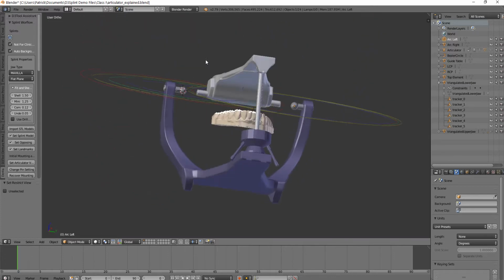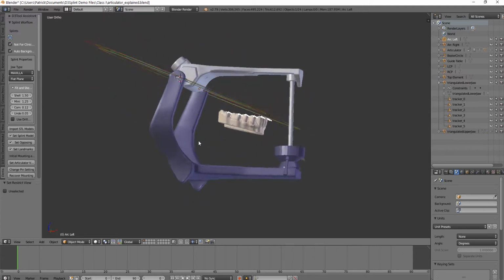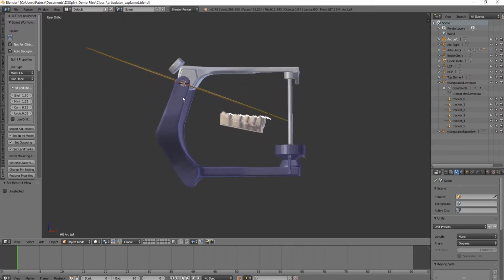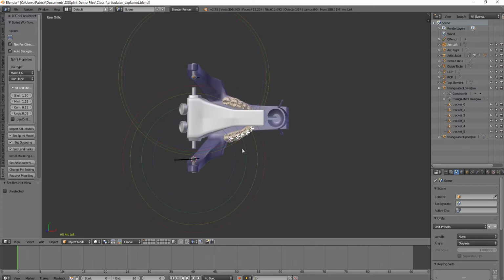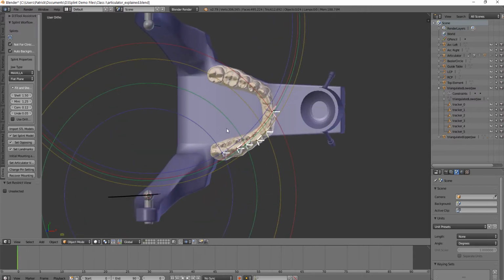And if we view these perpendicular to the plane that the condylar paths are inclined in, so we're going to look down on it from this direction. So not straight down from the horizontal plane, but from the tilted plane of the condylar paths. And we'll hide this top element here.